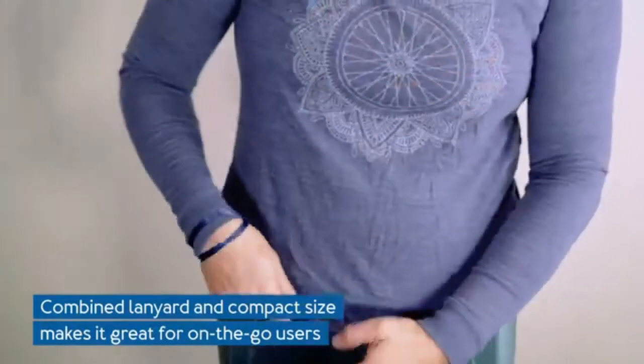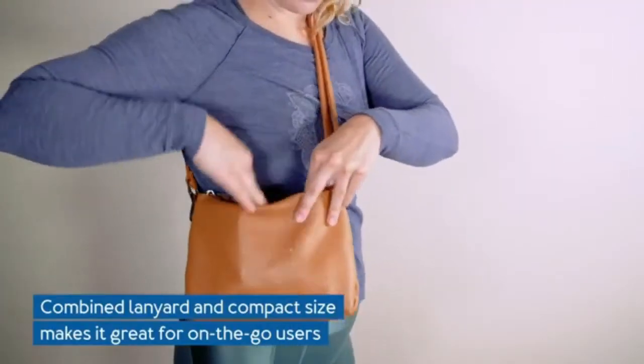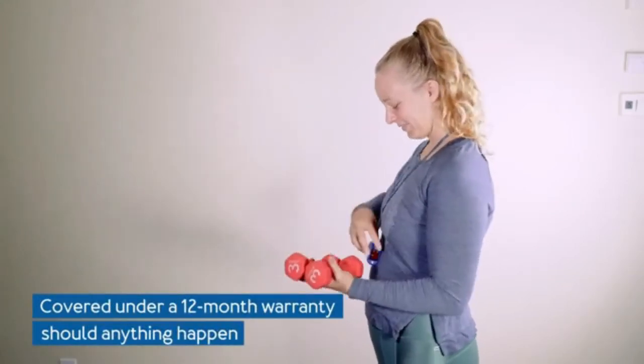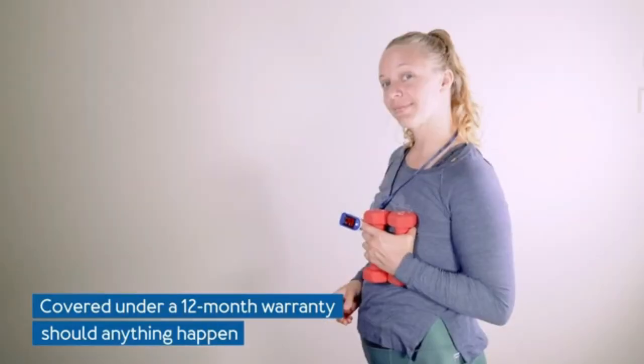A perfect blood oxygen saturation monitor for all ages. Easy-to-read display: the Rosco Medical Pulse Oximeter comes with a big digital LED display which shows your O2 saturation monitor readings in large, easy-to-read digits.